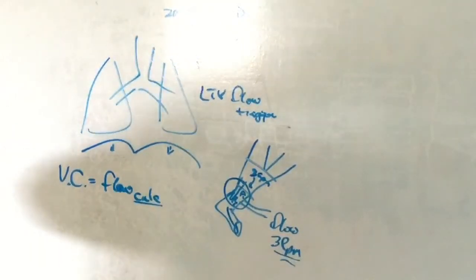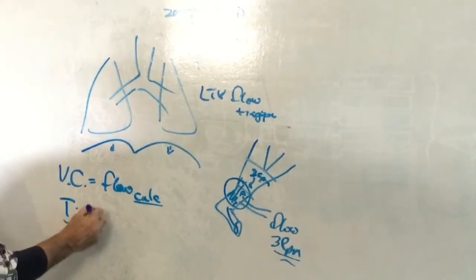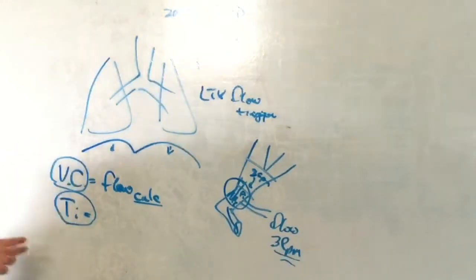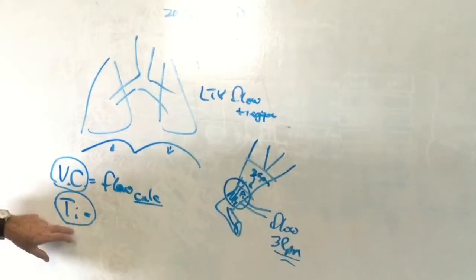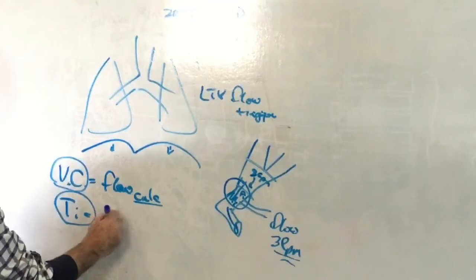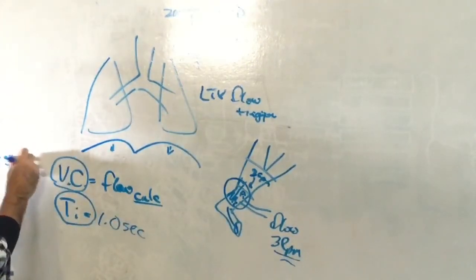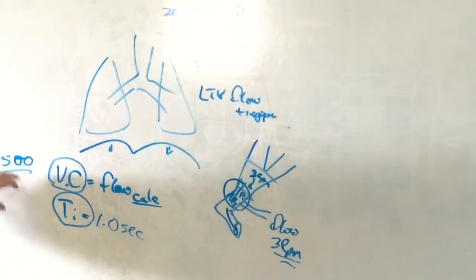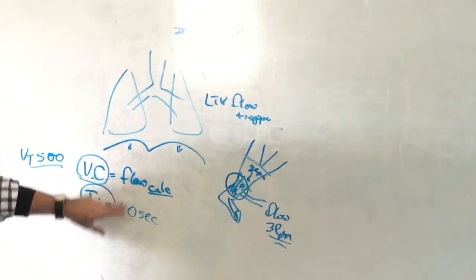And what that simply means is that given the inspiratory time that you've set, the machine says that within this inspiratory time, I will deliver the volume that you set. And the last few milliliters of that volume will enter the patient at the very end of that inspiratory time. So, for example, if you set this patient up for a 1 second inspiratory time, and they have a tidal volume of 500 cc's, and we're talking again in volume control, the last bit of that 500 cc's will be delivered at the end of that 1 second. And that's how the machine calculates the flow for you.